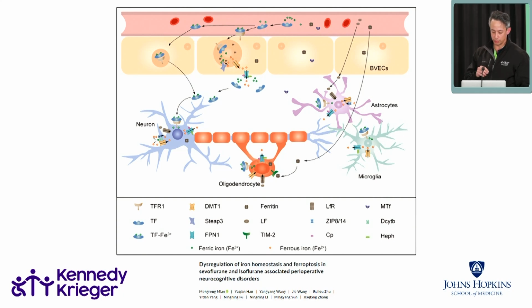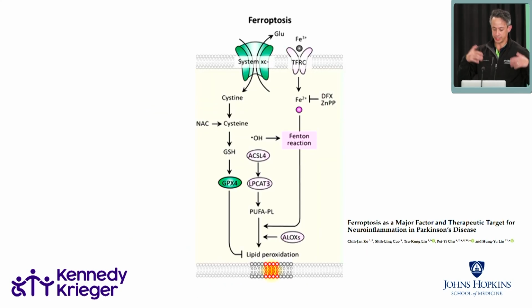So what sort of brings us? Oh, and the last thing is, as we age, our brains accumulate iron that we can see over time. So our caudate nucleus, our globus pallidus, the red nucleus. If you look at a kid and follow their MRIs from childhood into adulthood, you'll see normal iron deposition in the brain. It happens to all of us. So as it turns out, there's a lot of iron in our brain. So how do you tie this all together?